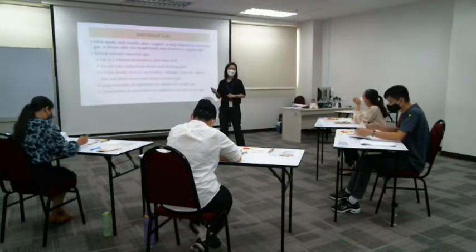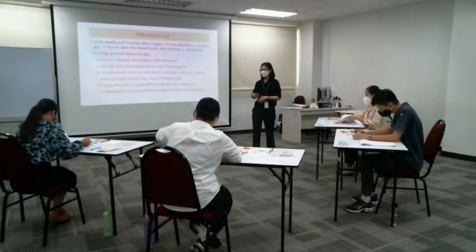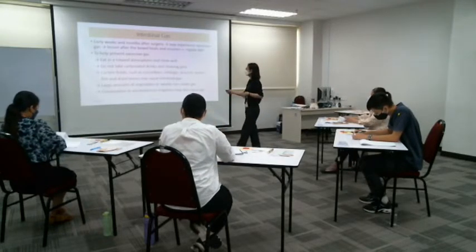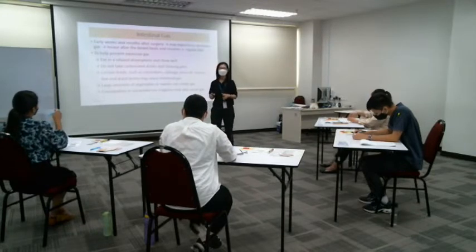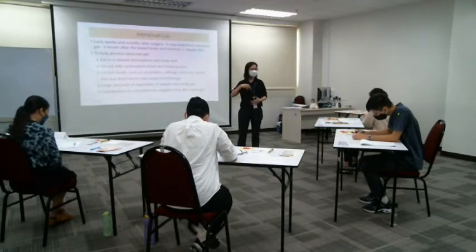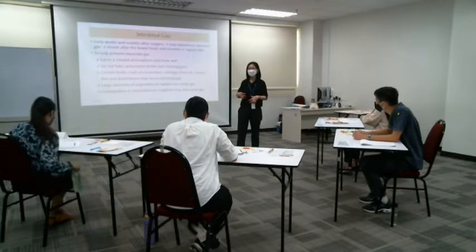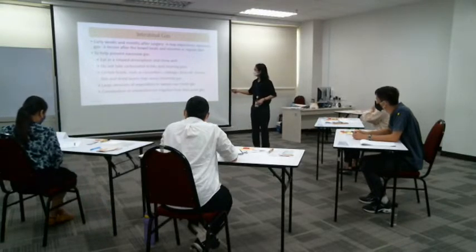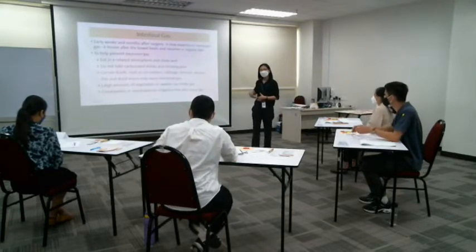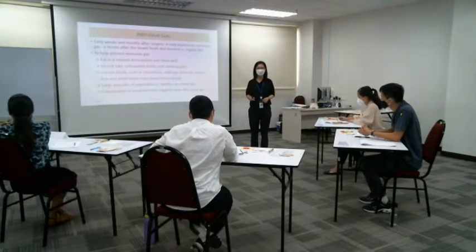Another problem, intestinal gas. The flatus comes out from the stoma here. In the early weeks and months after the surgery, the patient may experience excessive gas. The gut starts working on it and trying to adjust to this new way of working. But then it will become lesser. That means the gas will become lesser when the bowel heals and when the patient has already resumed a regular diet.